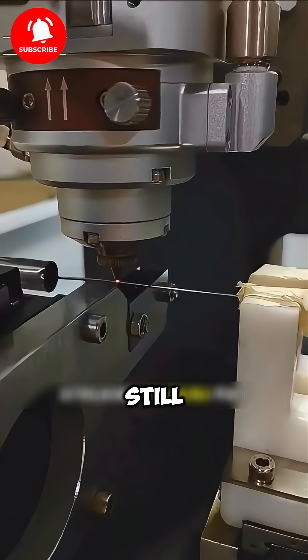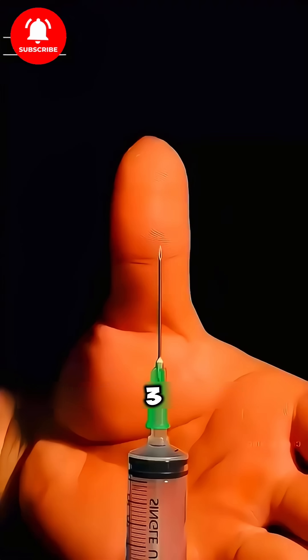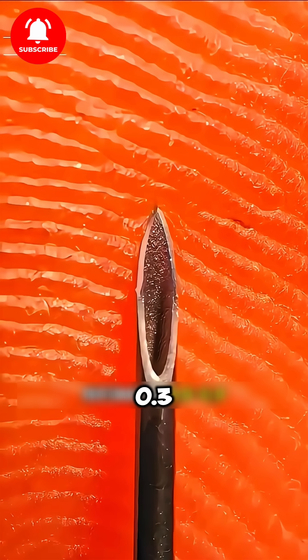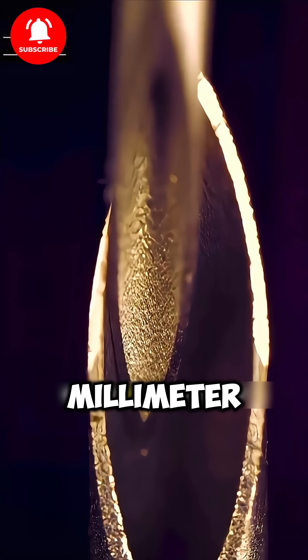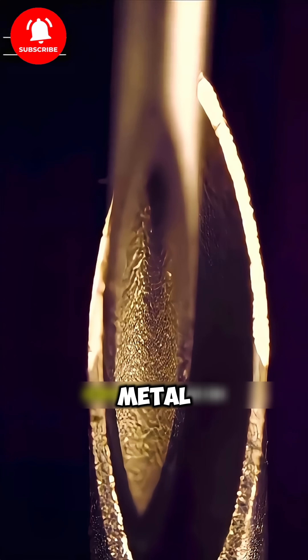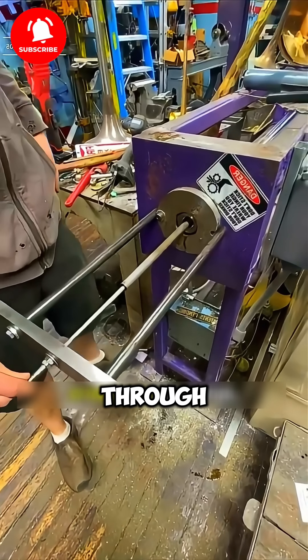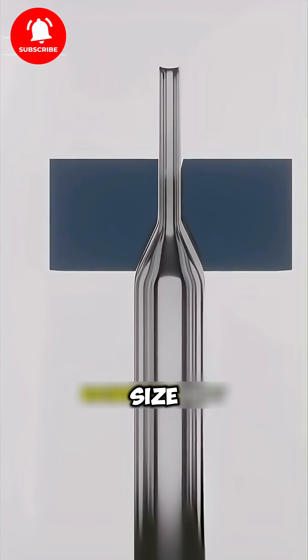But at first, the hole is still quite large, around 3 to 5mm. To create a syringe needle with a diameter of about 0.3 to 0.5mm, the metal tube goes through a process called tube drawing. The tube is pulled through various precision molds until it reaches the desired size.